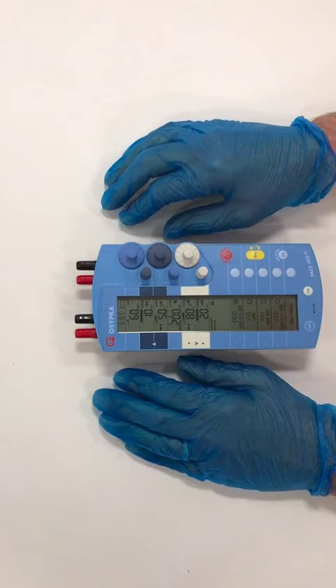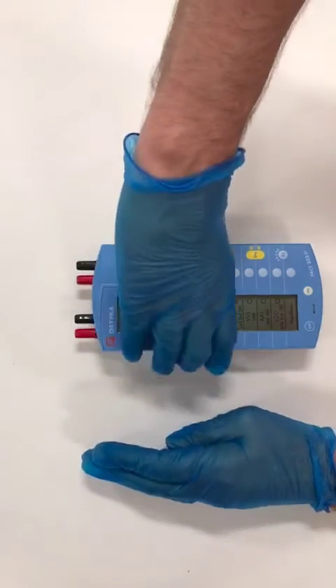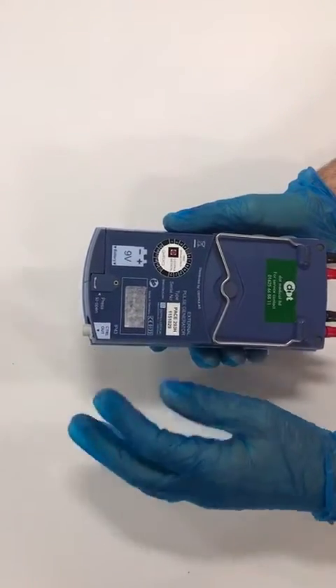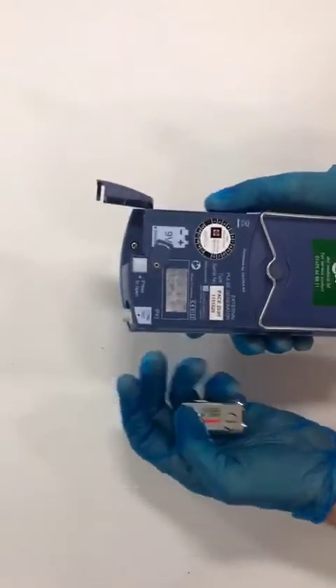To do so is very simple and it takes a few moments. You don't disconnect from the patient if you're already connected. You simply lift the device and turn it over. There is a little flap here — you move it to the side, press the button, and drop the battery into your hand.